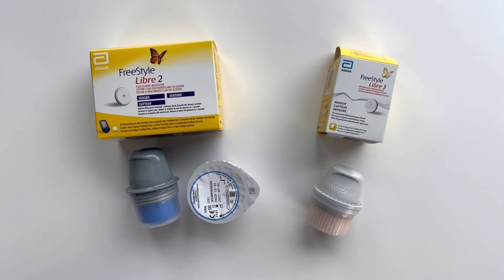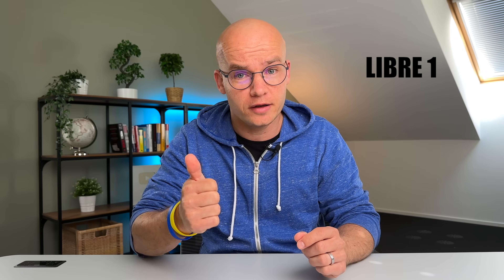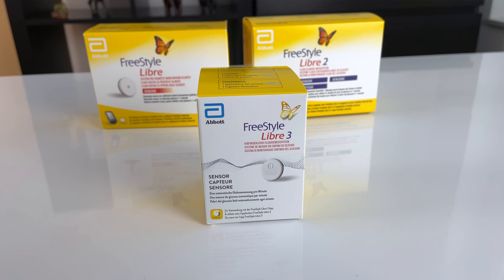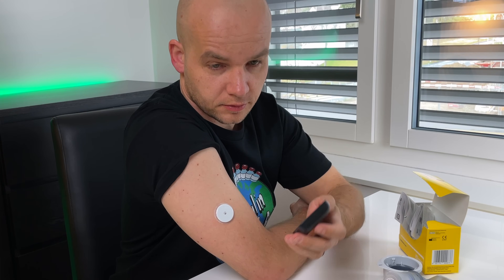So you finally decided to stop pricking your fingers and get started with Freestyle Libre. But you're not quite sure which version to pick — Libre 1, Libre 2, Libre 3? What are the actual differences between them? The decision process can be overwhelming. But don't worry, I will give you a detailed comparison and my personal experience with using each of these sensors, so you can make the right decision for you.